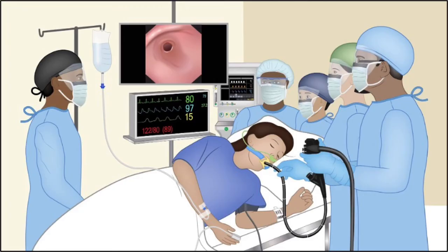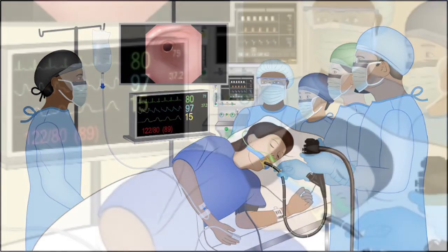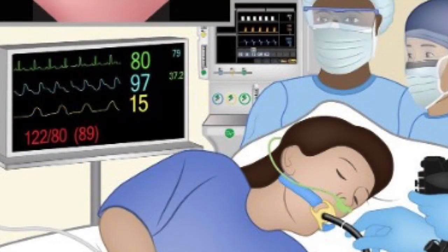During EGD, the anesthesiologist and the team will monitor carefully to make sure the cardiopulmonary status is maintained. They keep an eye on the heart rhythm, the blood pressure, the oxygen saturation.